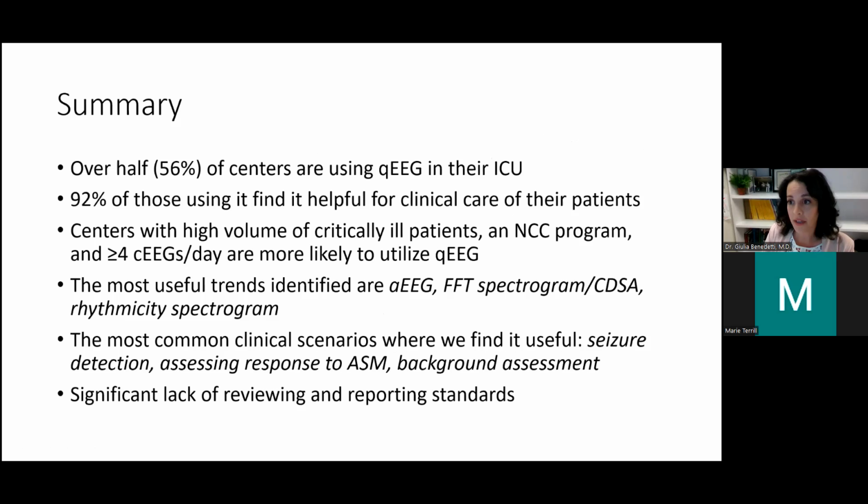So in summary, quantitative EEG use is increasing. More than half of the centers surveyed are using it, and the vast majority of people who use it find it very helpful in their care of patients. The higher volume centers are more likely to use it. These were the most popular trends. These are the most popular indications, and we have work to go on standardizing, and I think this field is very ripe for research and validation of this tool.